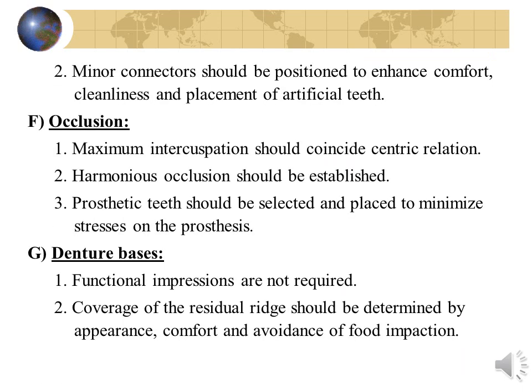Minor connectors should be positioned to enhance comfort, cleanliness, and placement of artificial teeth. Occlusion: maximum intercuspation should coincide with centric relation. Harmonious occlusion should be established. Prosthetic teeth should be selected and placed to minimize stresses on the prosthesis. Denture bases: functional impressions are not required. Coverage of the residual ridge should be determined by appearance, comfort, and avoidance of food impaction.